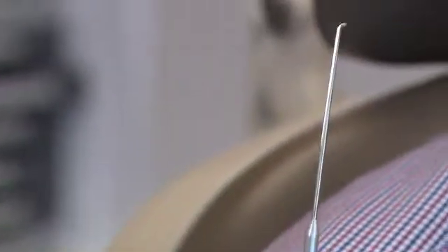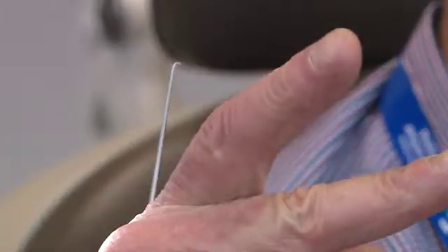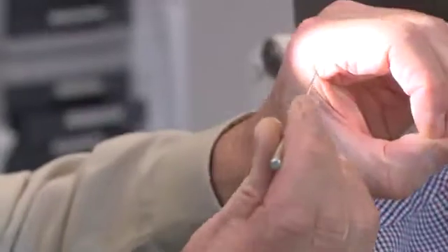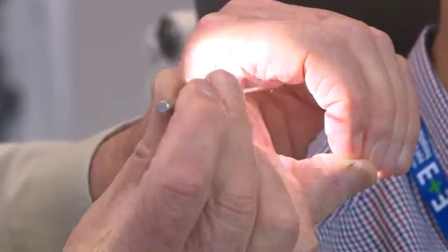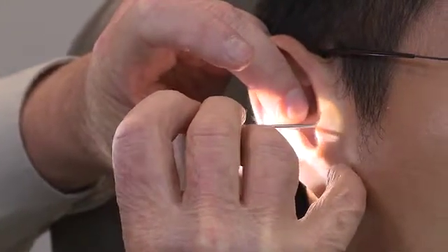Other instruments: if you're dealing with a foreign body in an ear, you don't use forceps — especially if it's something like a bead or a piece of stone, because almost invariably that action will not let you grab it and will just end up against the eardrum. This hook is actually easier to use. What you do is — if that's the ear hole — you keep it flat against the ear hole and you can go past almost any foreign body, then rotate it around and bring it out. I'll pretend I'm going into a gap, I've gone past it, I'm well and truly into the deep canal, turn it around and bring it out. I haven't actually touched the wall.